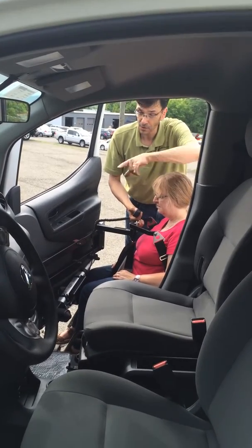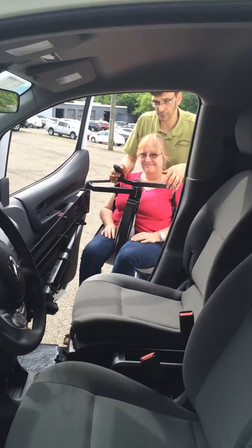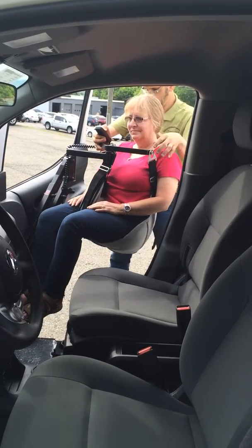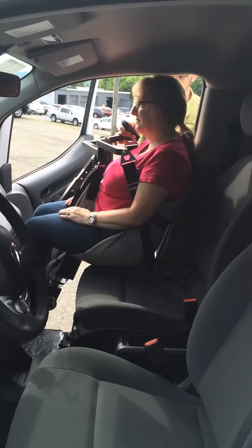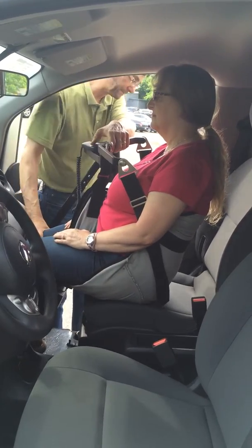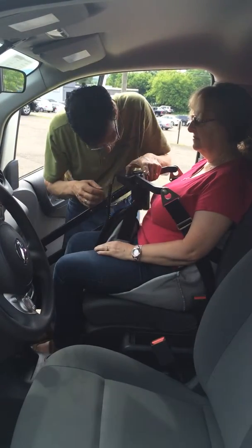Once the person is up in the air, we're going to point the feet toward the left front headlight. As soon as we are up off of the wheelchair, we're going to get away from the wheelchair and point in this direction, go straight into the vehicle. You'll see that the angle of our swing arm allows the person to go very far forward, thus missing this area even for a very large person. The process of transferring in is nice and smooth. Once we get in and over the seat, we have the ability to adjust the position as the person comes down, and you'll notice you're nice and square up against the back of the seat for a comfortable ride.